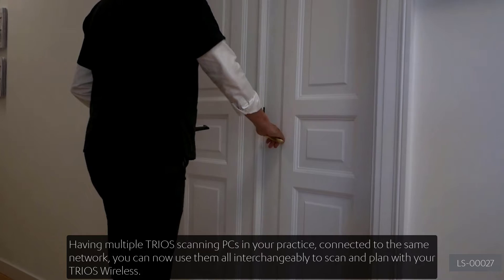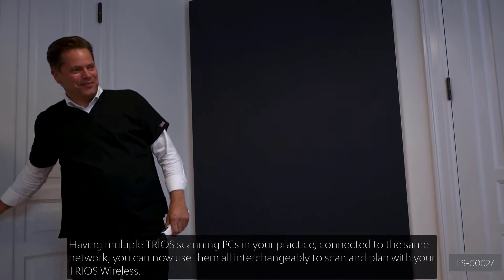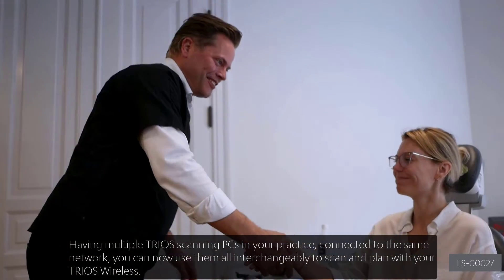Having multiple TRIOS scanning PCs in your practice connected to the same network, you can now use them all interchangeably to scan and plan with your TRIOS wireless.